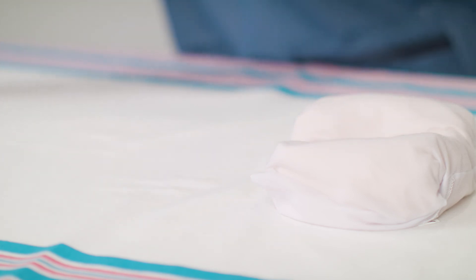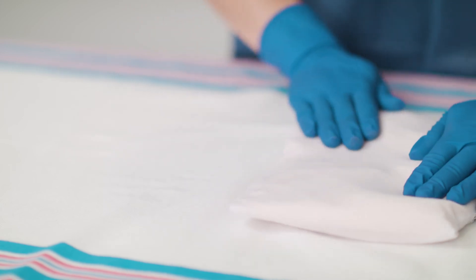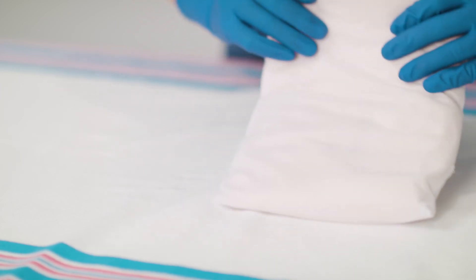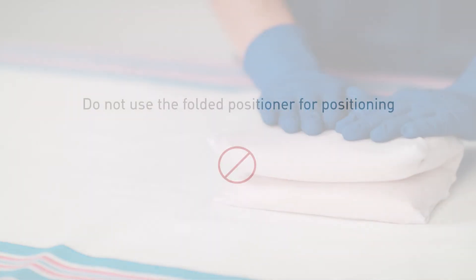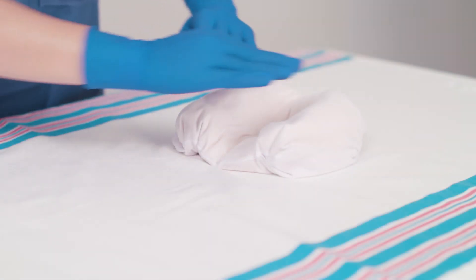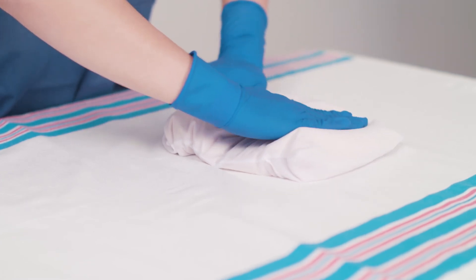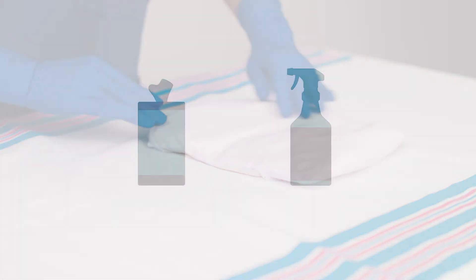Remove the small positioner if using and smooth out with your hands. Folding the positioner in half will attain a flat surface. Note: never use the folded positioner for positioning as it becomes very firm when folded. If the patient is in a minimum stimulation environment, you may need to have a team member elevate and hold the baby while a colleague uses the flat part of their hand to flatten out the positioner.